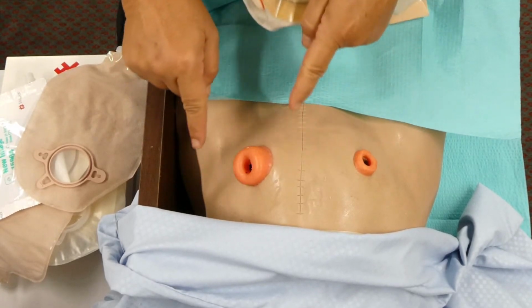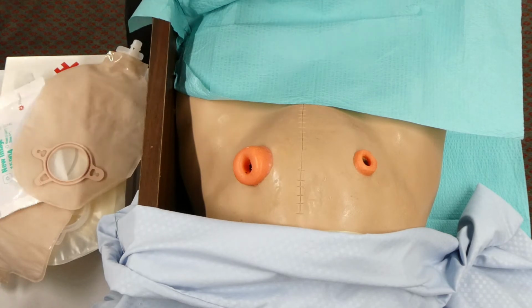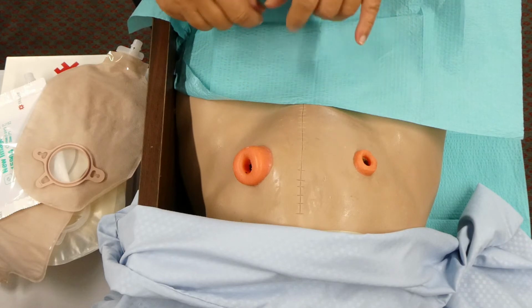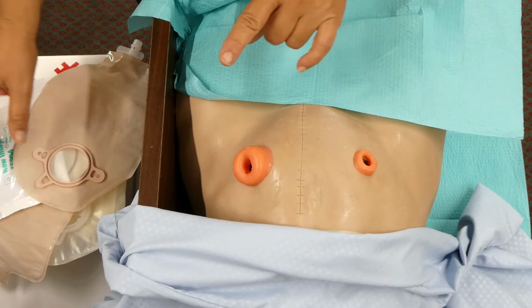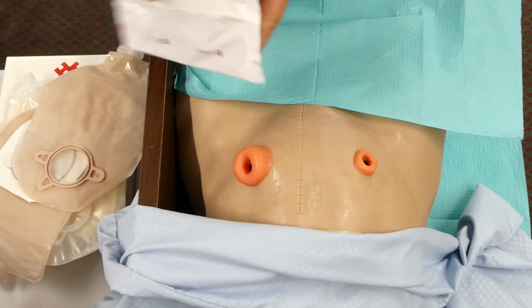You have to really push to get it to form in well, to form a good seal. There are some products that you can put on the skin to help this. One thing I'm going to tell you is that if you use regular wet wipes, they have lanolin or some kind of a moisturizer in there. It'll make it so that that wafer, the sticky part, won't stick. So you want to be careful of that.